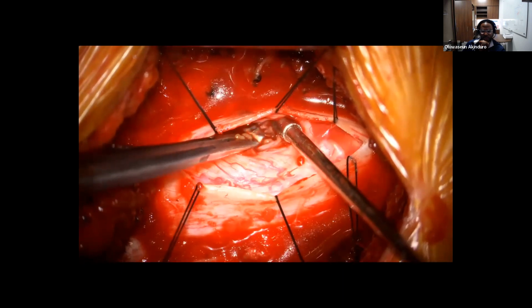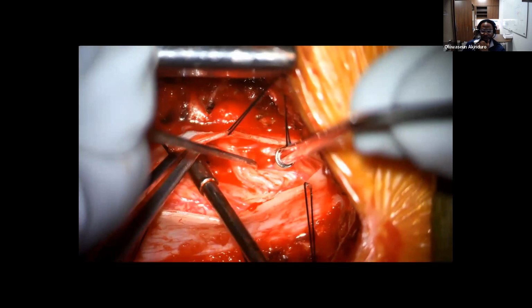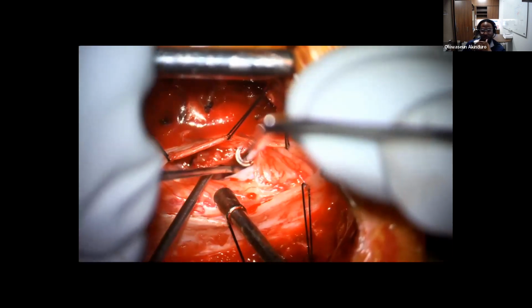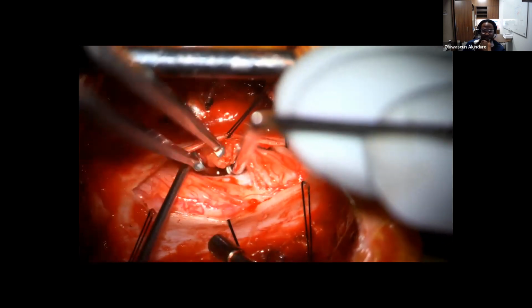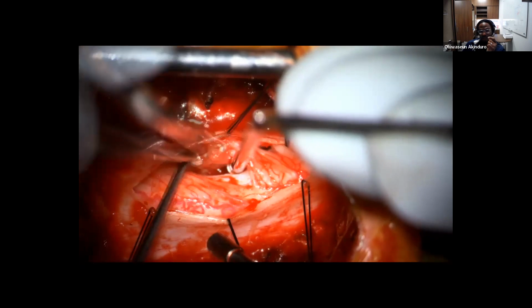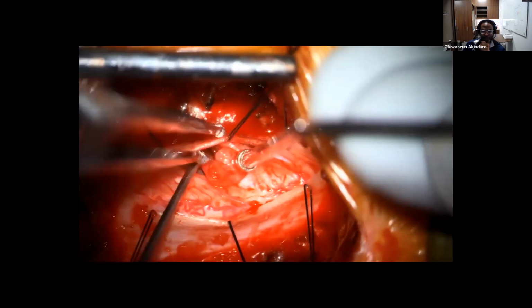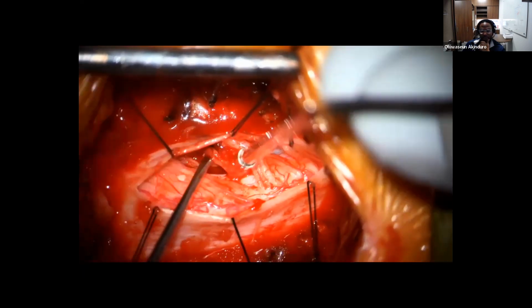So we started with some internal debulking, and how this case goes is 100% determined by the consistency of the tumor. Remember the last one of these I did, the tumor was just a rock, and it was just painful. I had the Sonopet in there, and even at the highest setting, it was just taking forever. Thankfully, this one was suckable, and we were able to take it out piecemeal.